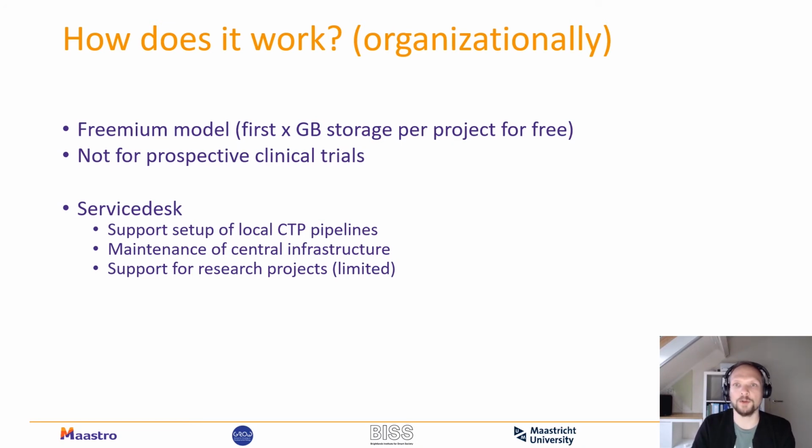For example, hospitals think that they properly de-identified the images, but if we look at the private DICOM tags, there are still physician names, patient names, or other identifiers in these data elements. Therefore, we give support during the setup of a research project and for every submitting site for a specific research project.